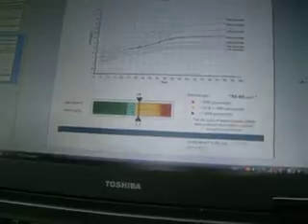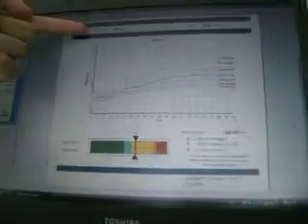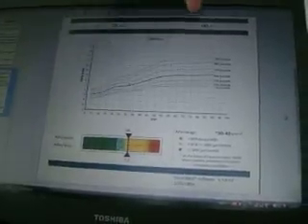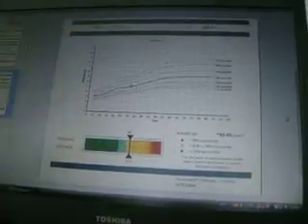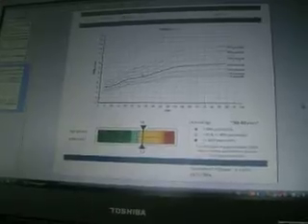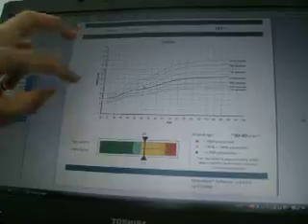Technically perfect measurement. This is a calculated pulse-wave velocity and the return time. Of course, pulse-wave velocity is calculated from the return time. As a very, very good feedback to the user and to the patient, we give the age-related pulse-wave velocity value.